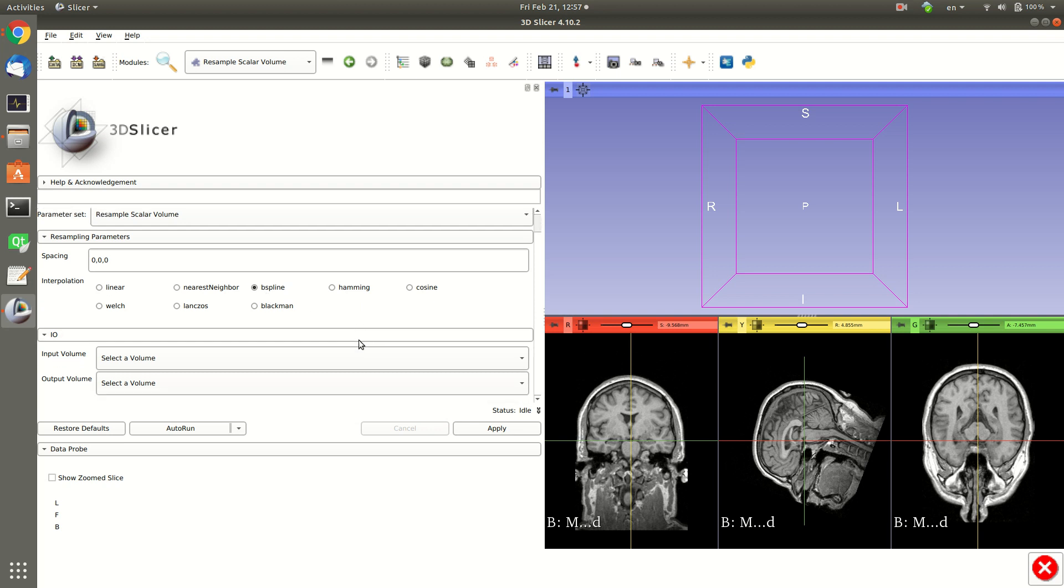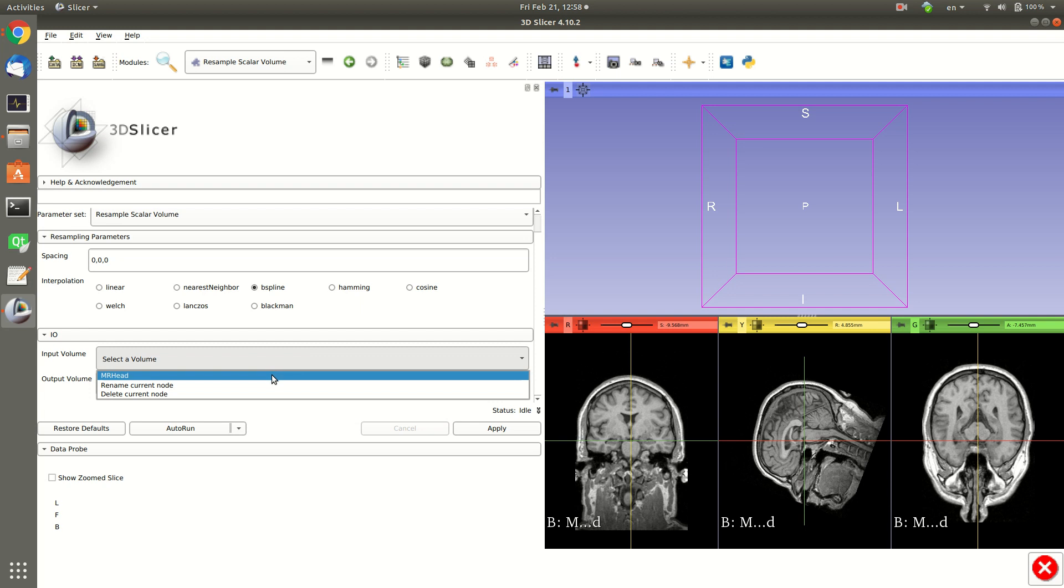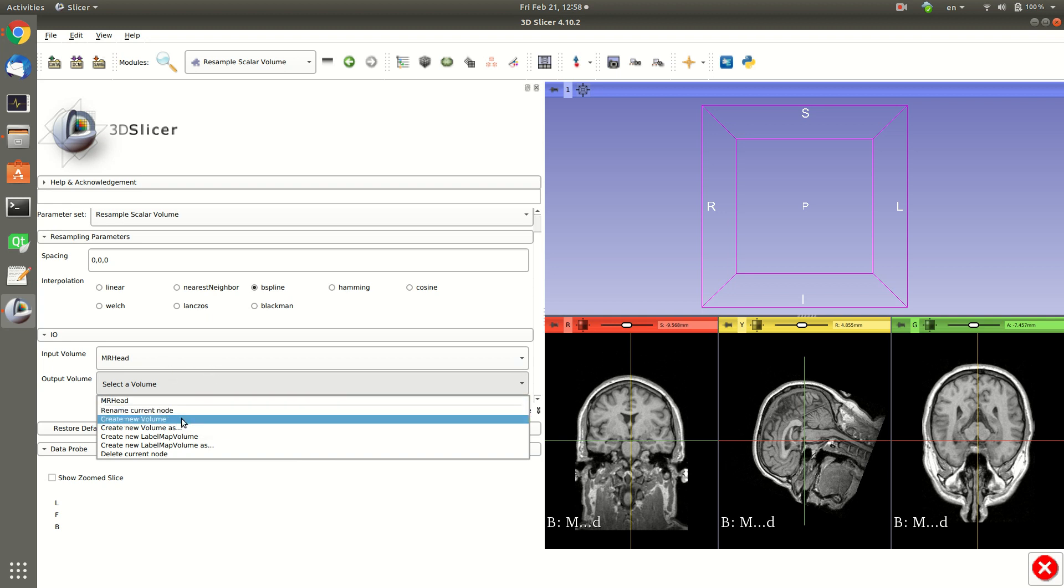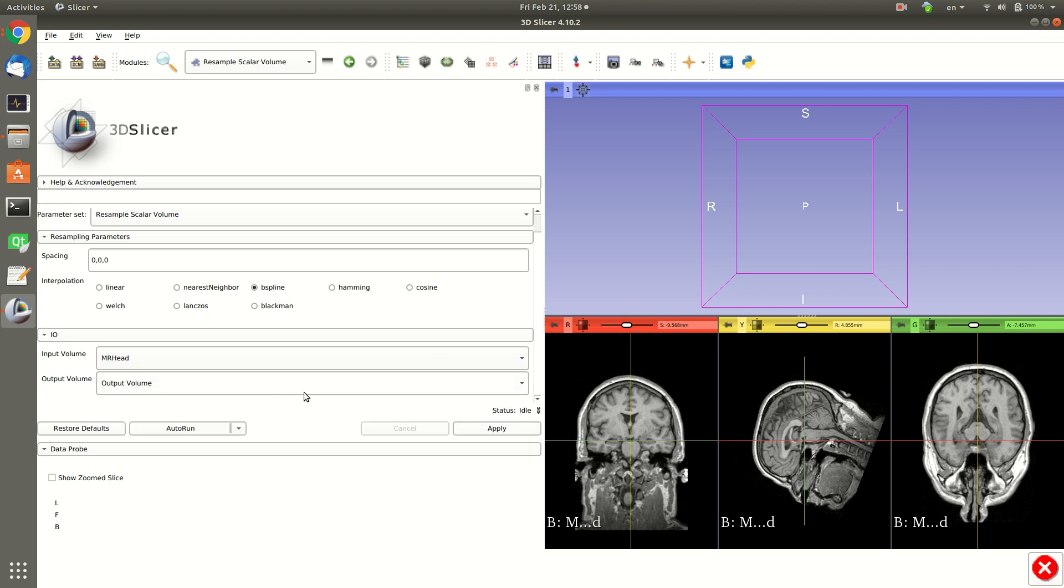Now I select the input image and I select the output image. I can apply the resampling to the same image or I can create a new volume, which is what I do now.